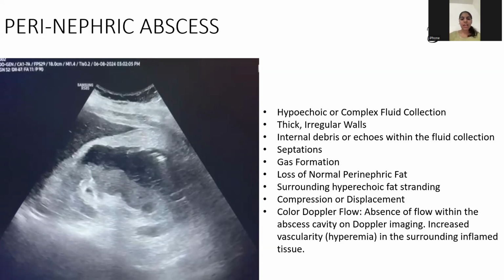Color Doppler flow was performed, and it showed that there is an absence of flow within the abscess cavity on Doppler imaging. However, there is increased vascularity or hyperemia in the surrounding inflamed tissue.